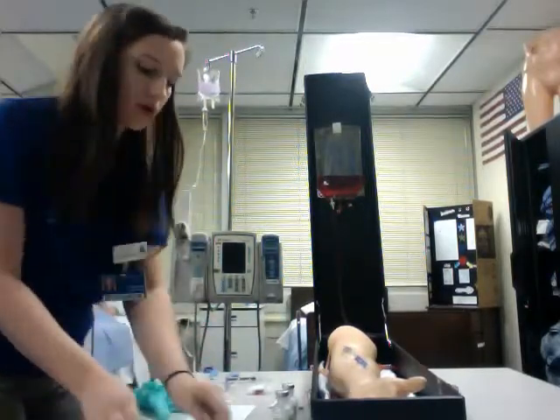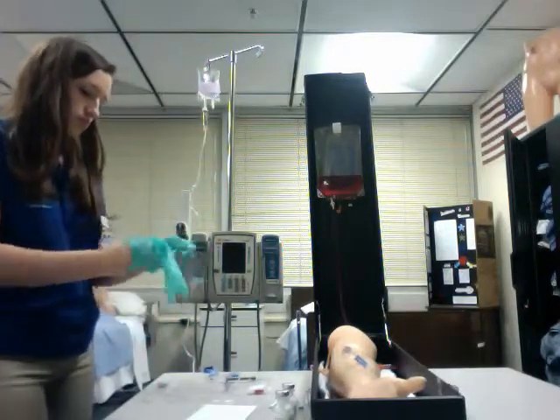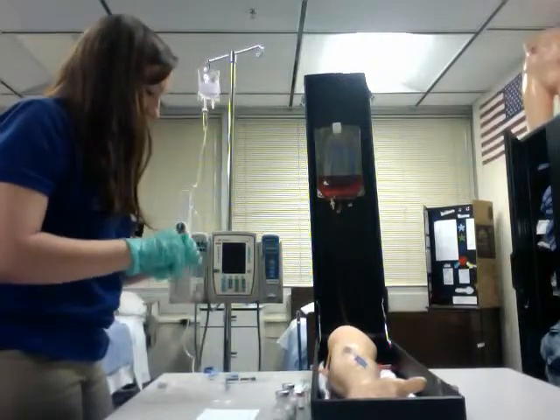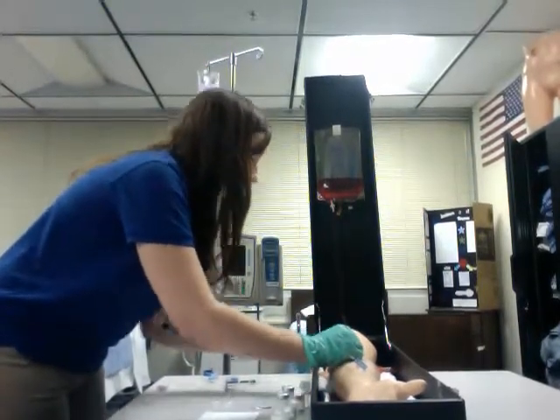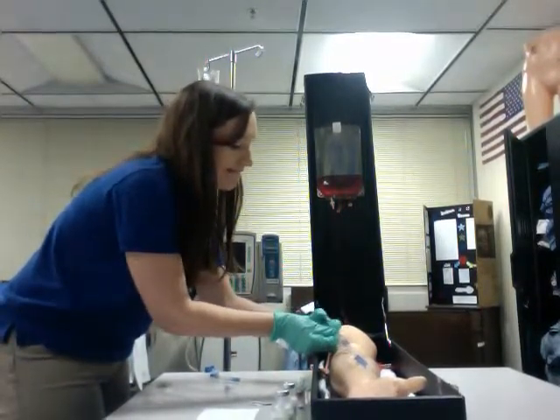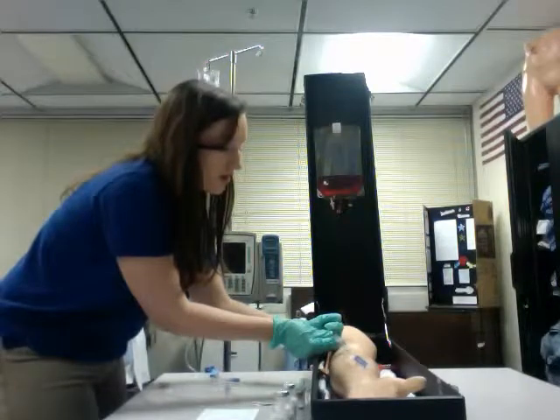I'm going to go ahead and wash my hands, put on my gloves. Alright, so I'm going to get an alcohol swab. We're going to start by flushing the IV, make sure it's still patent, and clean off the site. I've got my saline flush. So I'm going to do the ASASH method. I'm going to aspirate back to make sure there's still a blood return, and I see blood. So I'm going to go ahead and use the push-pause method and administer some normal saline. And I'm going to do about 3 milliliters.